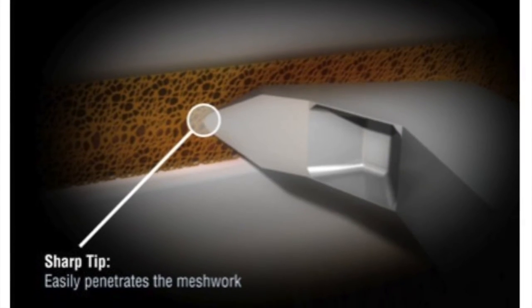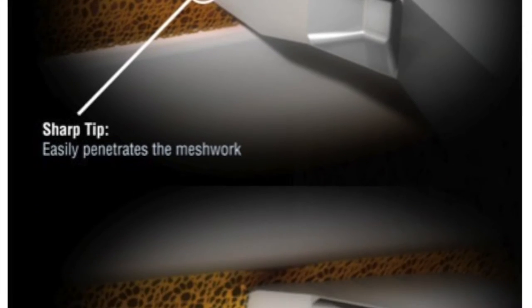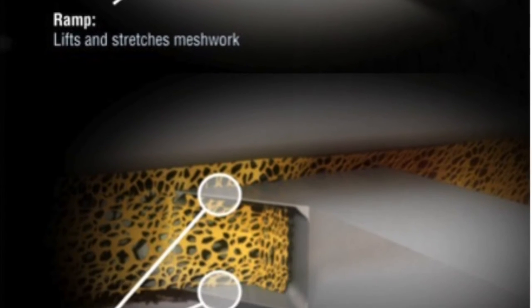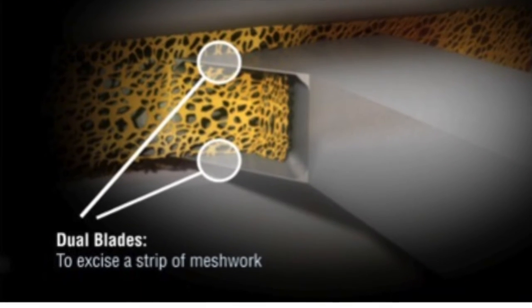One of its key features is a ramp that puts the trabecular meshwork on stretch as the device is advanced, which aids in the clean excision of the trabecular meshwork with the parallel blades on either side.